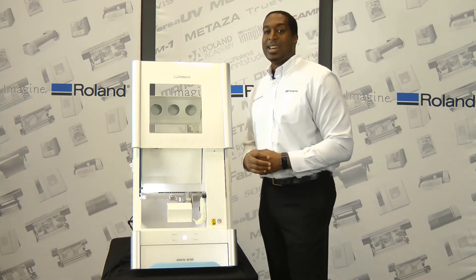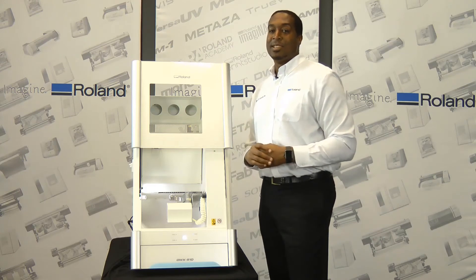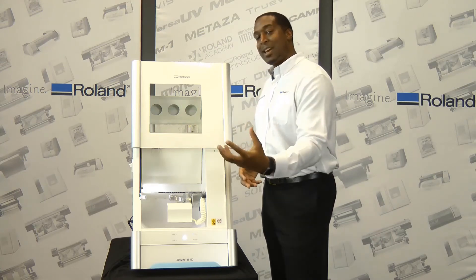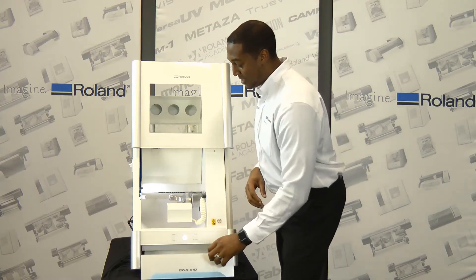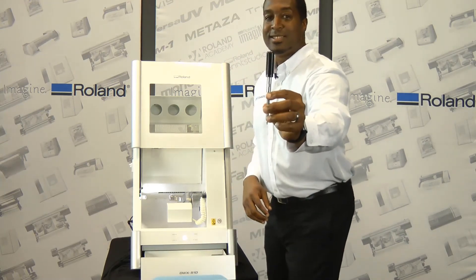The new C-clamp design, as you can see here, is for easy insertion of disc-type material. Take one disc, slide it from the left to the right, and use a torque wrench, which we actually send with the machine. It looks just like that.